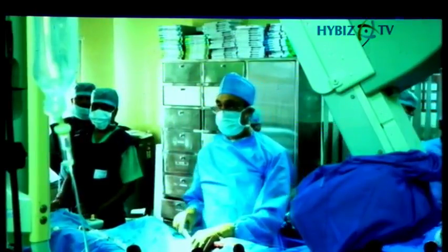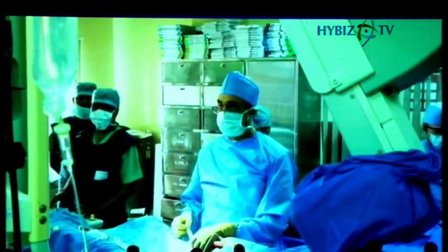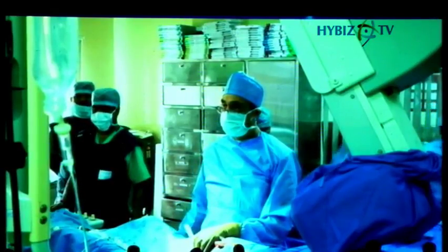Thank you. We can't see anything. Can't you see the index angiogram?